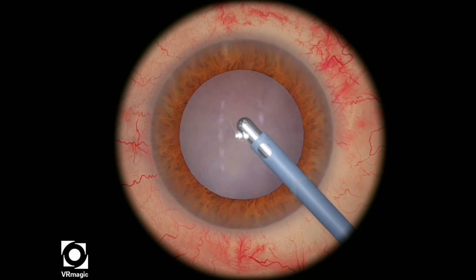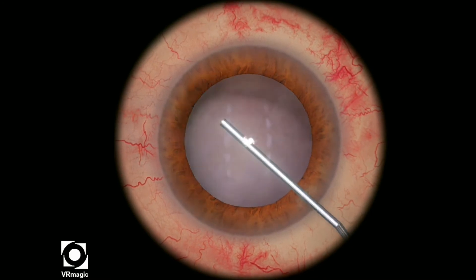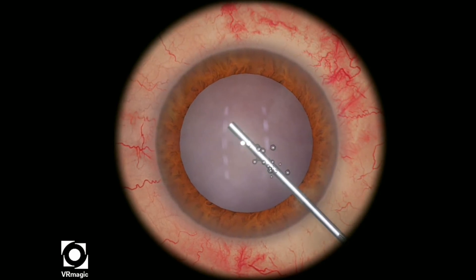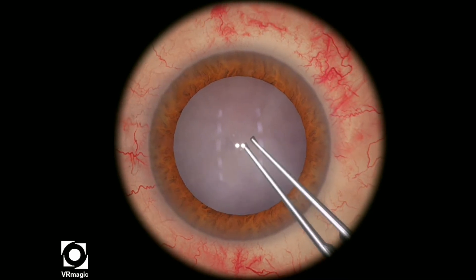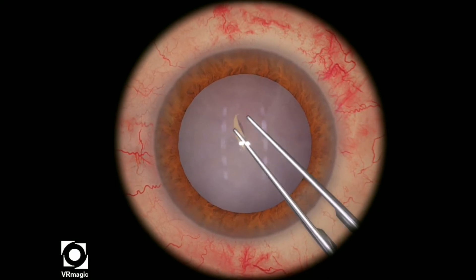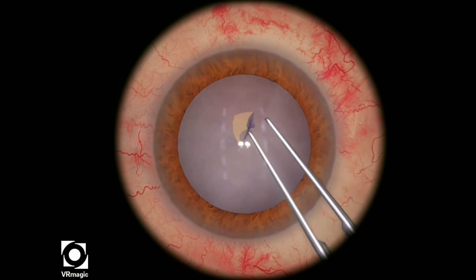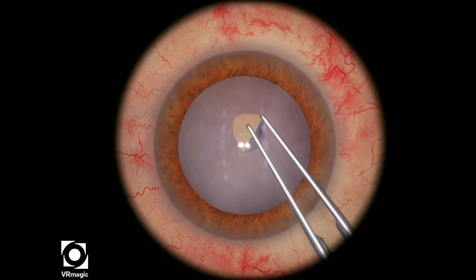Here I'm just aspirating very, very gently. My aspiration or vacuum levels are around maybe 200. Then I fill the AC again with viscoelastic, filling it to almost half the viscoelastic cannula. Notice that the raised flap is quite small — that's a good thing. You want to start off relatively small because if you over-aspirate, you're going to create a very large tear, almost an Argentinian flag sign.